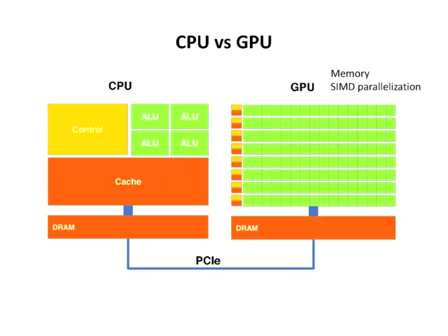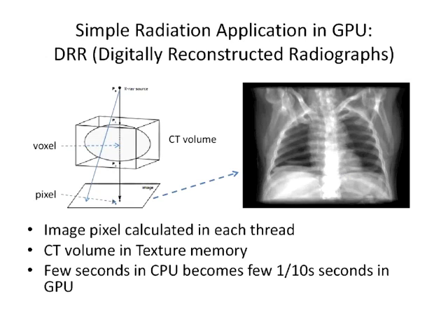I think currently microprocessors work the same way. So that was one of the weak points in the GPU. And another biggest weak point is the GPU doesn't have much intelligence compared to the CPUs. You have to be strictly SIMD parallelized, or you lose great performance. To coordinate all these 500 cores, you have to follow the unit SIMD parallelization, which GPU people call warp size.